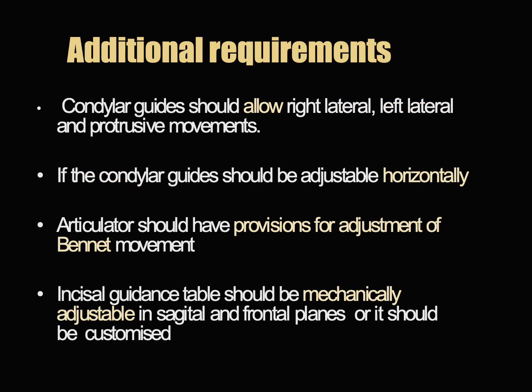Additional requirements are: the condylar guide should allow right lateral, left lateral and protrusive movements. If the condylar guide can be adjusted horizontally, there should be provision for adjustment of lateral movements as well. The incisal guidance table should be mechanically adjustable in the sagittal and frontal planes or should also be able to be customized.